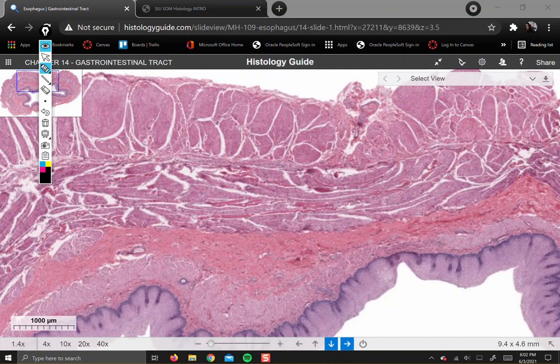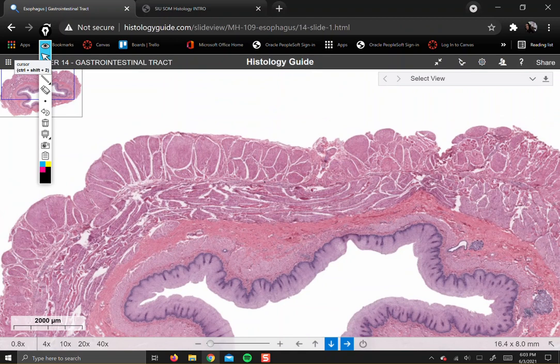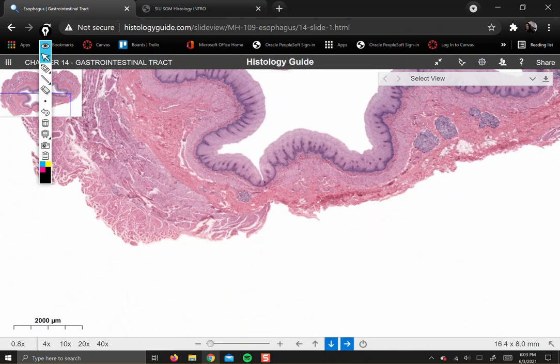Now, in addition to that, there should also be some manner of outer covering, either serosa or adventitia, so it's going to be my job to figure out which. And the esophagus is basically stuck to the back of the trachea with adventitia because it's a more robust connecting tissue. So let's see what that looks like.